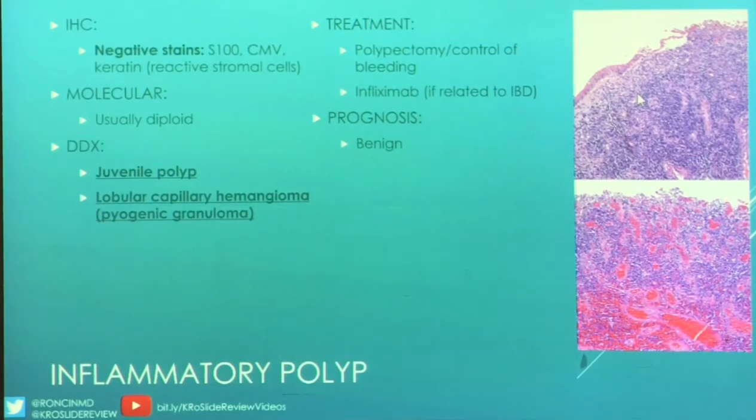And then what these are showing is here we have intact epithelium and then it's gone, so you have erosion. And same thing here, no epithelium, but we have lots of new blood vessels. And this is probably a lot of neutrophils. It's hard to tell because I made the picture smaller, but this is granulation tissue, just to show you what that should look like.